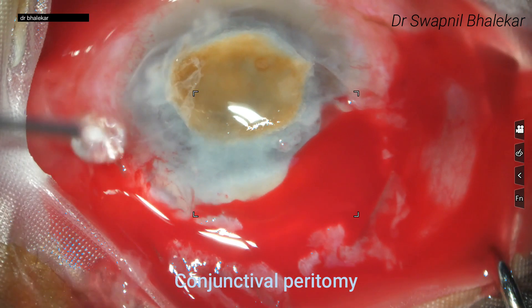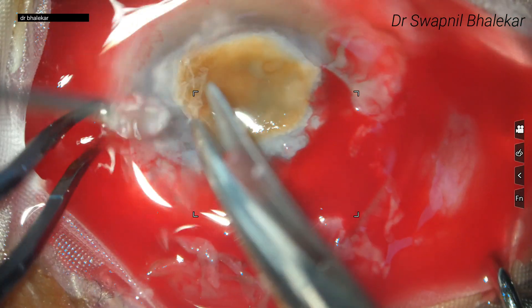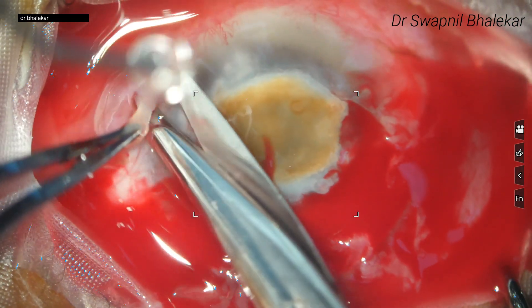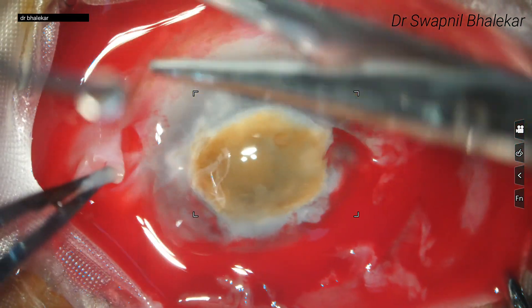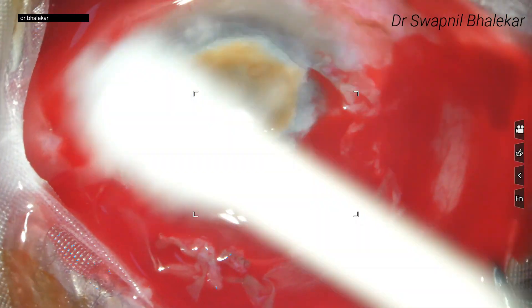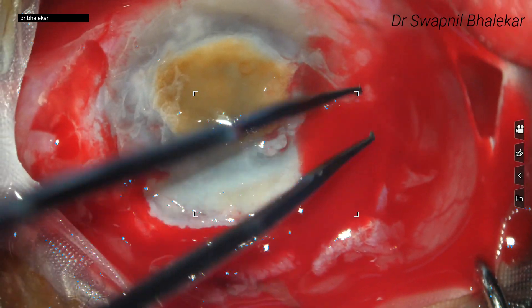This is very important as it will also make space for proper suture placement in the periphery. Here you might notice that though there is a lot of bleeding, I haven't used cautery to stop the bleeding. That's because in this case the infection has spread beyond the edge of the cornea, and if there is any possible remaining infection in the recipient's scleral rim, it will heal faster in the vascularized tissue than in avascular cornea. That's why I have avoided cautery in the peripheral area.